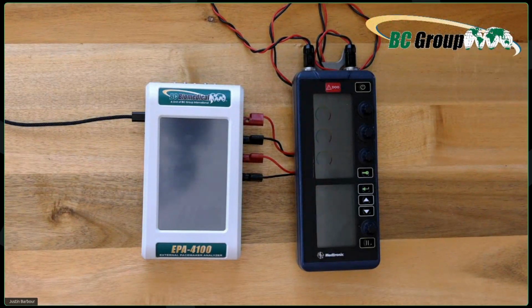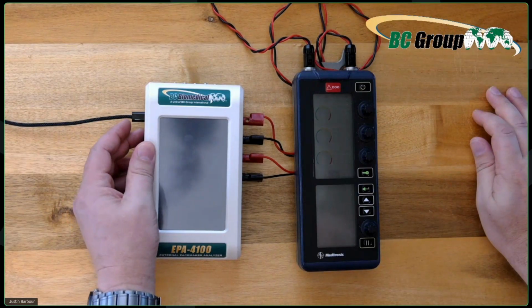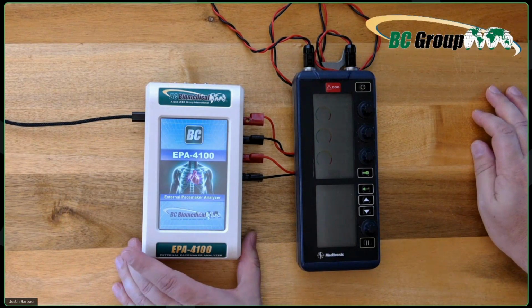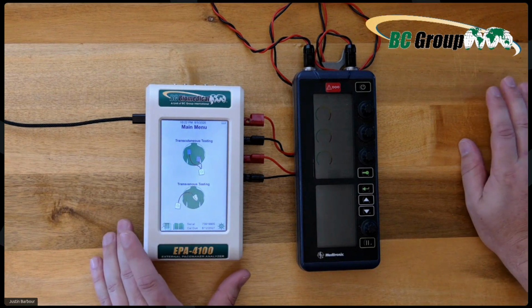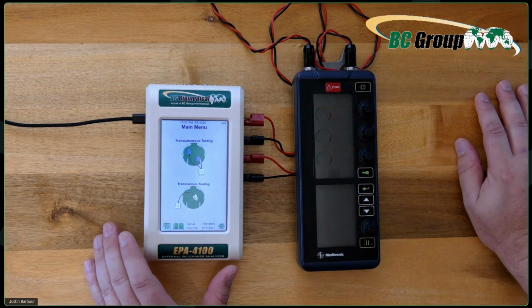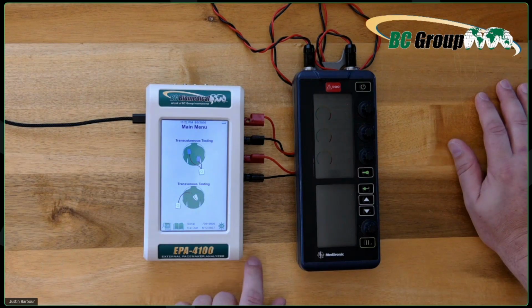So let's go ahead and boot this up, folks. So here is the EPA-4100. This guy is very brand new to the market. In fact, it's not even for sale yet. And that is because these devices are just like defibrillator analyzers, in that you have to fill out a 510(k), and it has to get filed with the FDA in its final form.